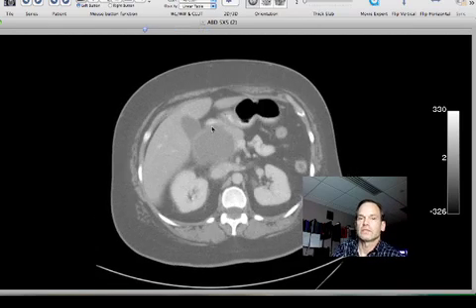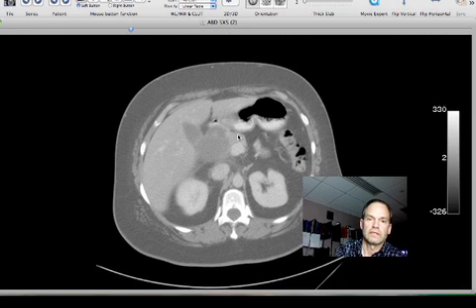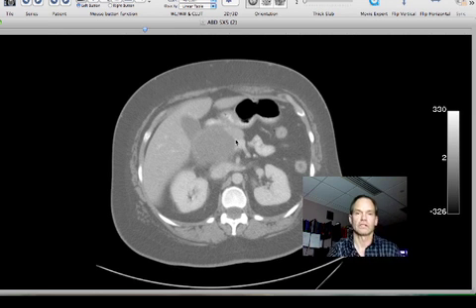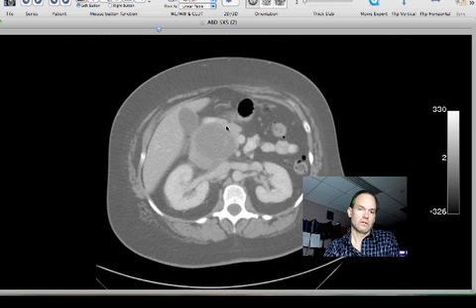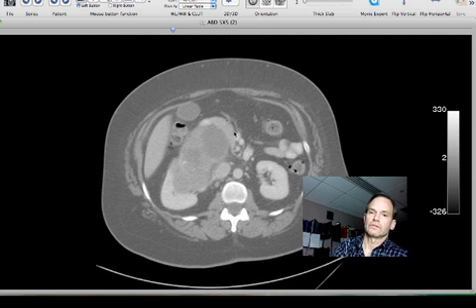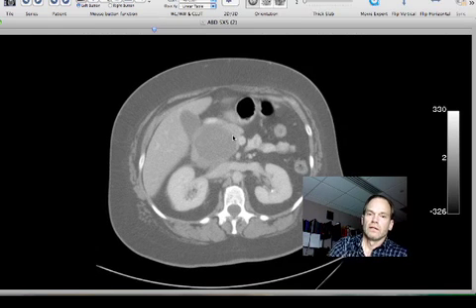Also, if you look more closely at the pancreas, you can actually see that the pancreatic head is just displaced. So again, here's the pancreatic tail, body, and then we get into the head area here. Now, if we go down a little farther, you see the big mass is squashing the pancreatic head, but this is the pancreatic head here. And you can even see this little lip of uncinate process sticking out from the pancreatic head there. You see that best right here. So this is all pancreatic tissue, and you can actually see that the pancreas itself is intact. So it looks like it's renal.